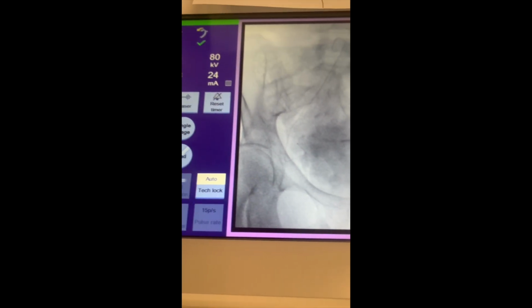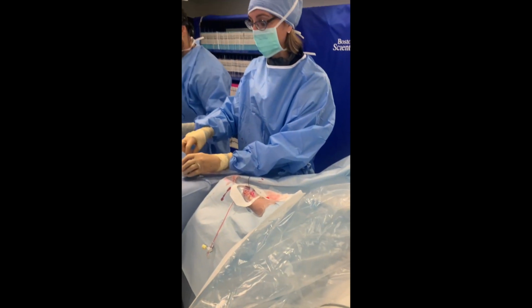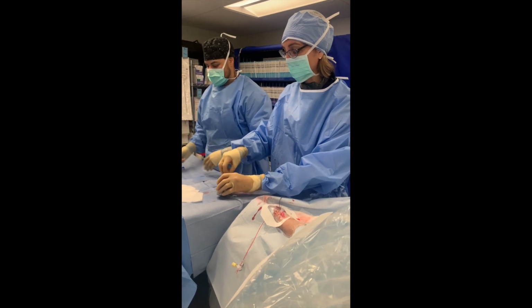I always fluoro when I'm doing this, unless it's hugely huge. And the downside is a little bit more radiation, but as you can see, we're still at 3.2 minutes, and we'll probably be under 5 minutes for this side. But you never know how fast things are going to stop, and you never want reflux. Feeling anything? Nothing. Surprisingly. Sleeping like a Disney princess that you are, just asleep, picture perfect.